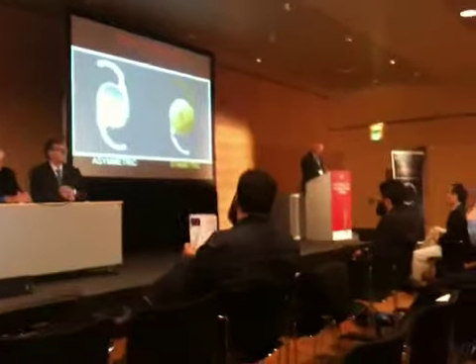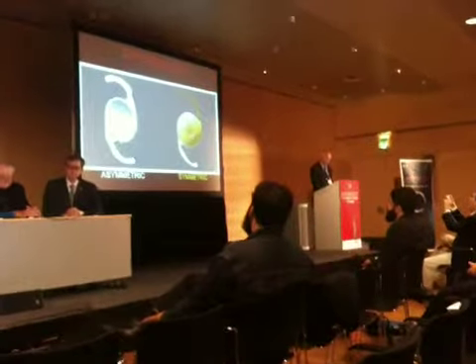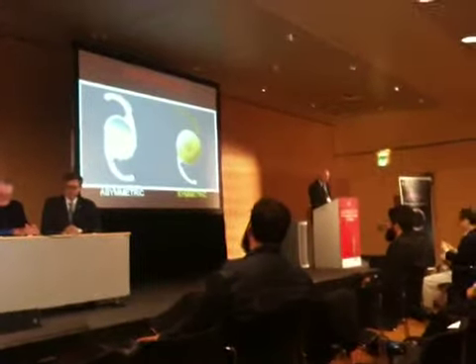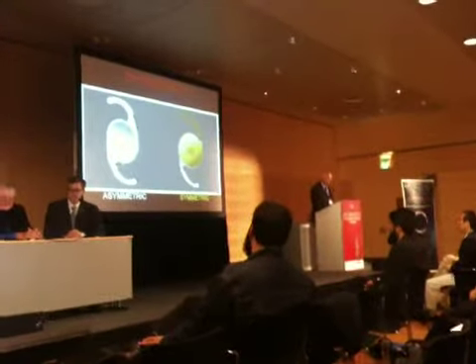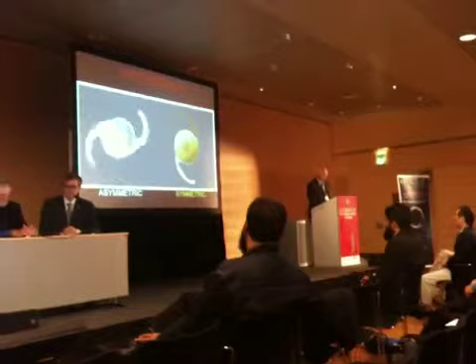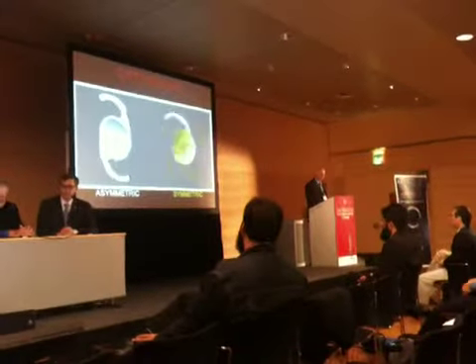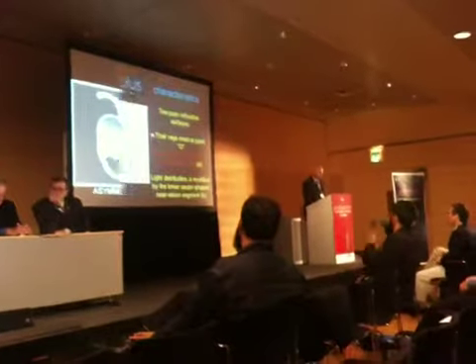Because this lens is different from the diffractive IOLs: it doesn't have the rings, but overall it has a sector-shaped near vision segment that you can see here. So when you rotate the IOL, the focus for near rotates with the IOL and doesn't remain in the same position. If we rotate the lens, you can see that the focus rotates too. Instead, if we rotate a normal diffractive IOL, the focus remains in the same position.